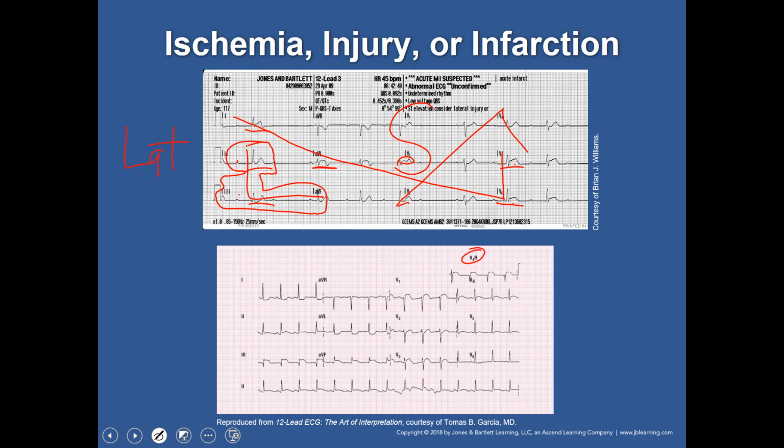Now, I've also seen newer research over the last year or two that suggests that may not be as accurate as they thought. So what I always say is you refer back to your local protocols when you're determining what to do. If you have a patient that meets the criteria to do the right-sided 12 lead, and then your protocol says to not do this or to do that, you just follow that. Hopefully those are vetted protocols and you'll be good to go.